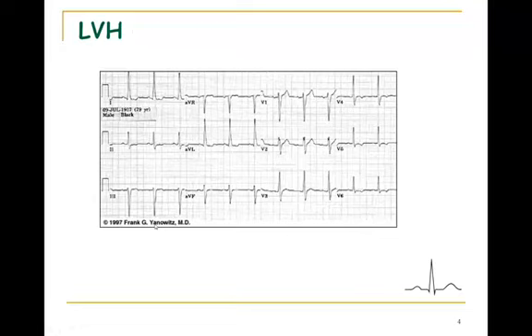What you will also notice is the predominant S wave in lead 3. In normal EKGs, you should have a normal mean electrical axis, where you should see QRS complexes in 1, 2, and 3. Overall voltage should be positive, but you see a lot of negative voltage in lead 3. If you had plotted this out, you would have gotten a left axis deviation from this person.